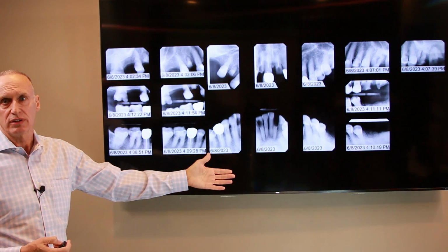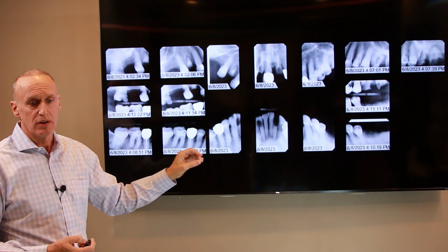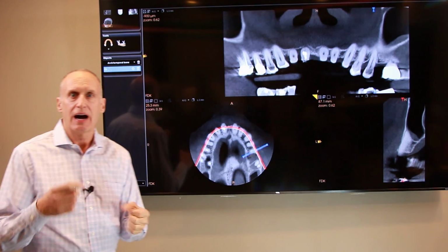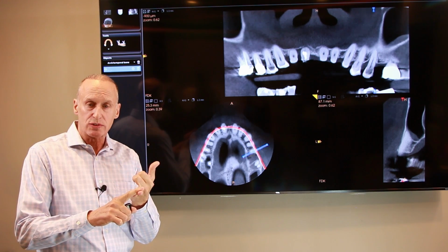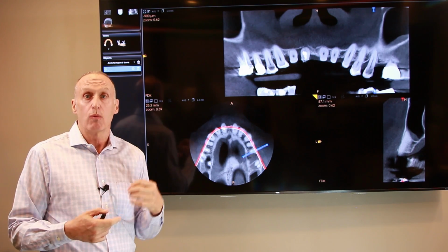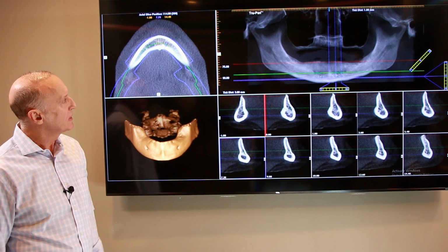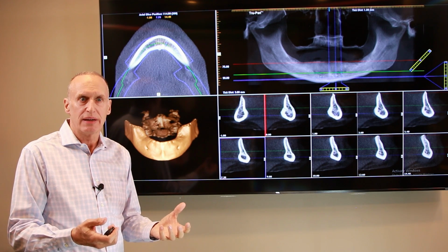So we're going to look at a full mouth series of x-rays. Make sure we're not making any mistakes on viable teeth or bone volume. We're going to take panoramic x-rays. We're going to take CT scans and we're going to review them. Because again, I'm making decisions on implant position from an engineering standpoint, a biological standpoint, and in that biological standpoint, do you have enough bone for an implant where I want to put it? So we're looking literally every tooth, every slice, and trying to come up with a plan on how we're going to treat every patient individually.